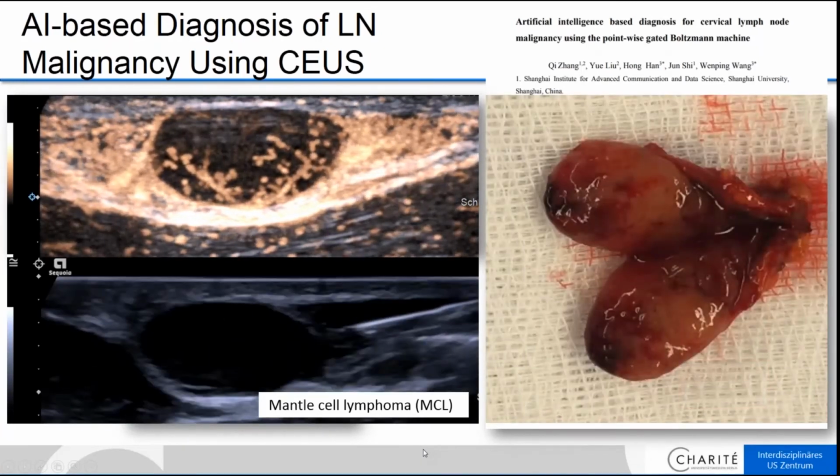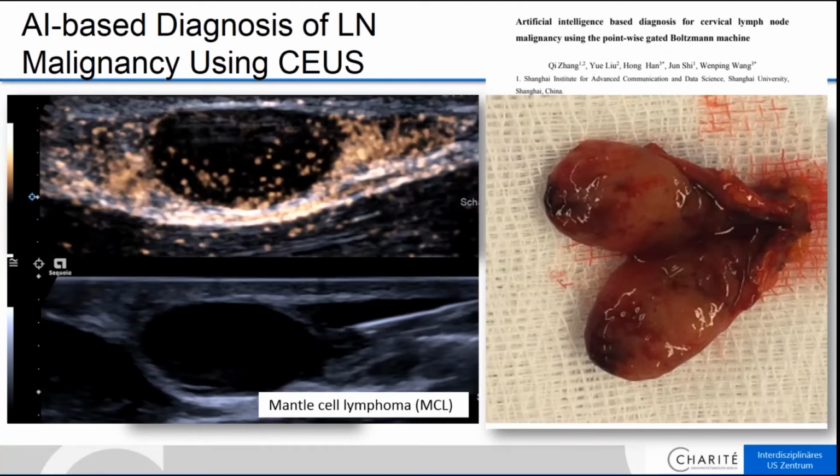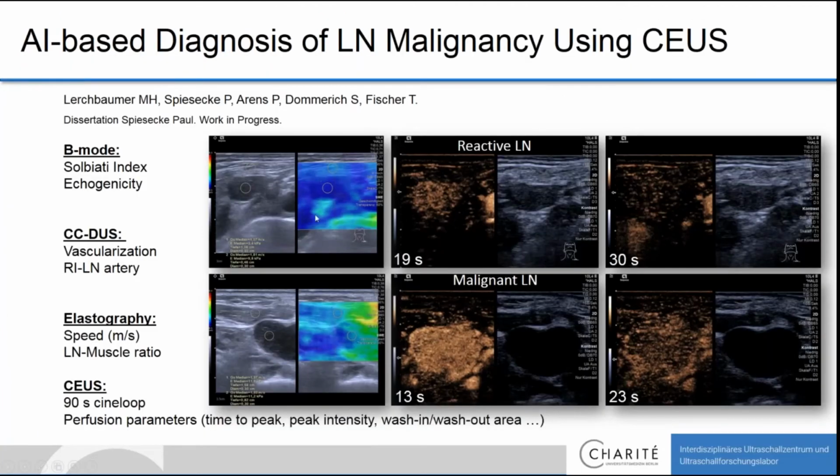And this is how it looks in the original image. We use the whole concept now: elastography, soft appearance, and contrast inflow in this reactive enlarged lymph node, no washout, in contrast to this stiffer metastasis here with an early inflow and very fast washout, and everything together with the shape and with all other features should be integrated and adapted to our AI tools for the future.